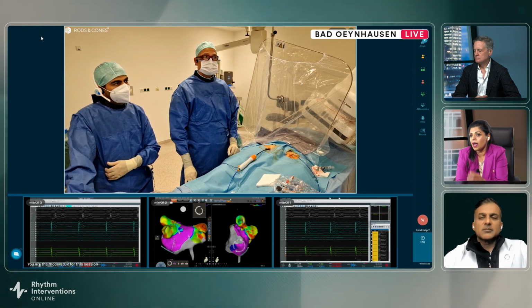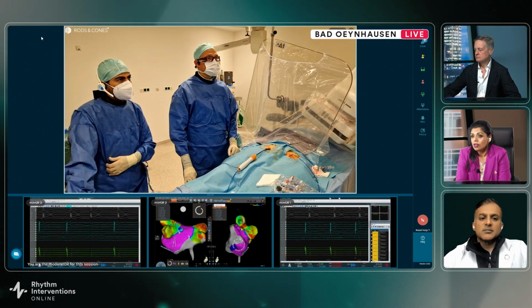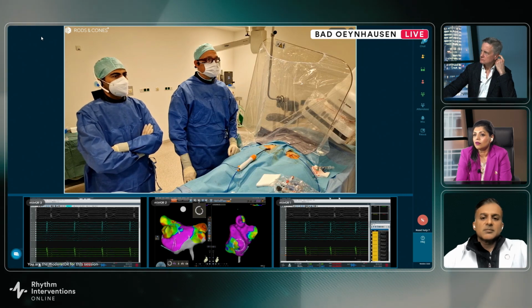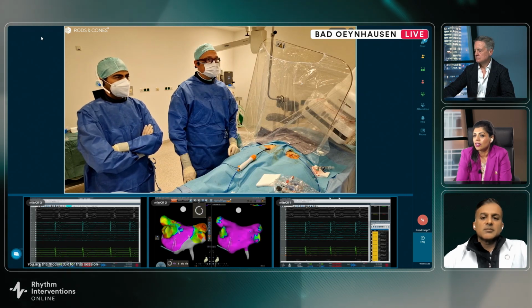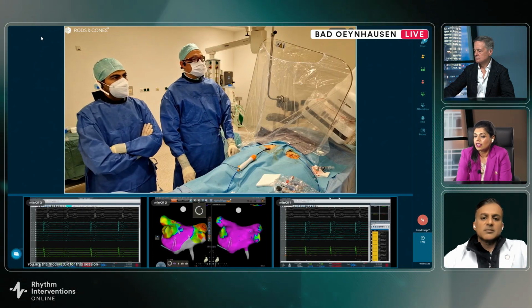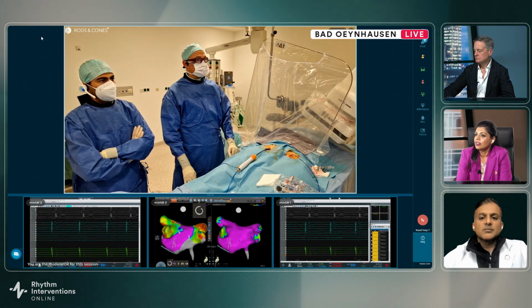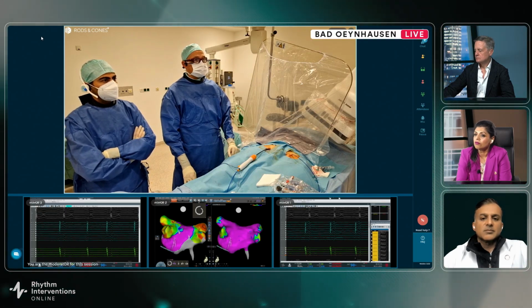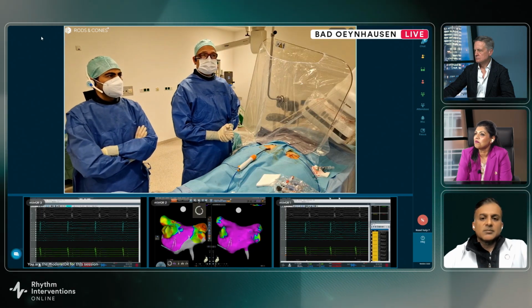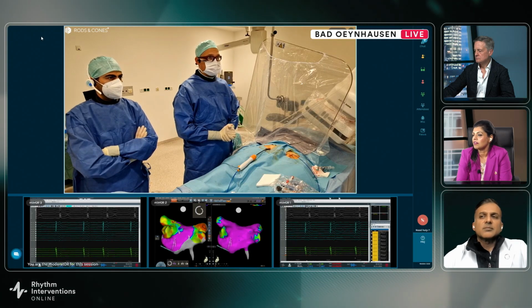Like this map that Christian's got, it shows very good voltage posteriorly. So I would feel very comfortable leaving that posterior wall behind, not touching it, and taking the minimalistic approach of just PVI only. But if I see a very narrow channel, or if I see that the voltage is bad, then I don't hesitate to take that posterior wall out. And regarding your repeat ablation, I go and clean it up if I see borders that look shaggy. I would say that, but it's not very common that we have to do that at all.